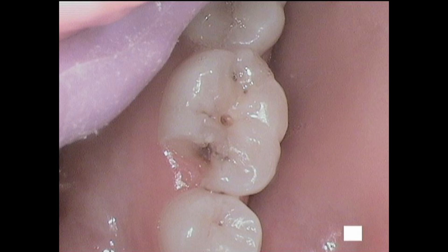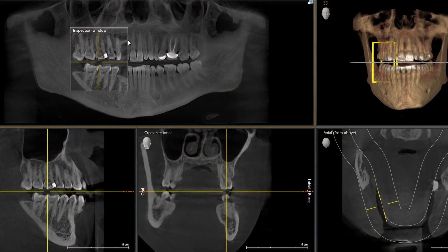She could hardly speak or eat. We do every exam, whether it's on an emergency basis or as a regular patient, we do this cone beam radiograph. This cone beam radiograph is a three-dimensional radiograph of the patient's jaw — CBCT, cone beam computed tomography, basically a CAT scan.